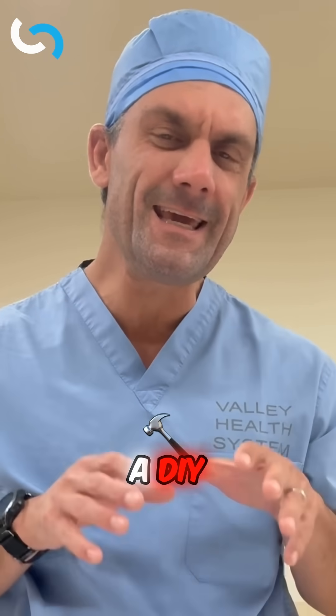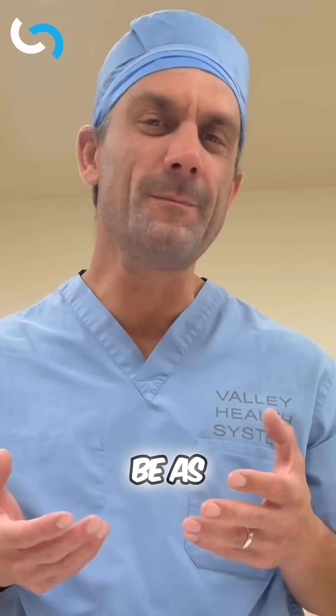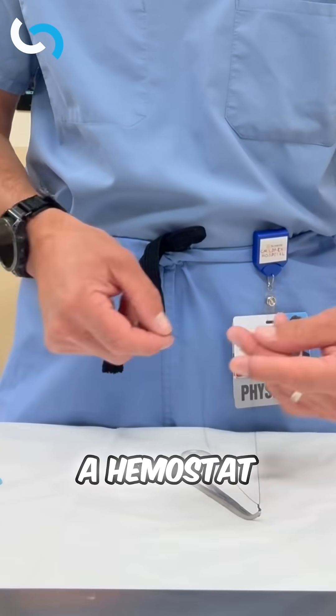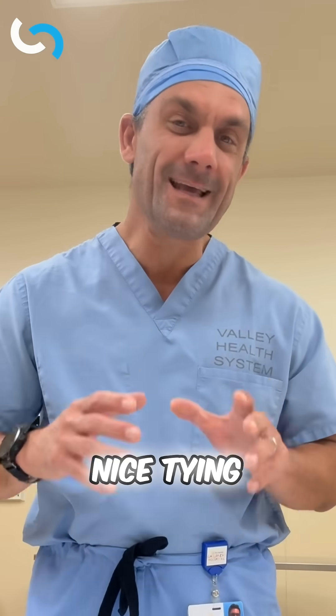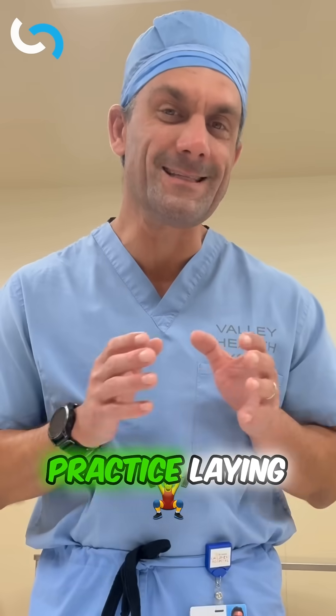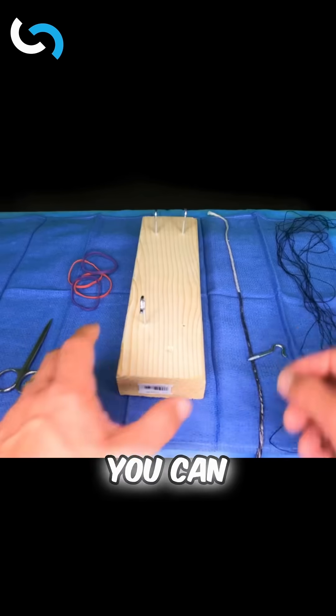An easy way to build a DIY knot tying station at home can be as simple as having a piece of suture on a hemostat or a tonsil clamp, or we can get a nice tying setup to give you some appropriate tension so you can practice laying those knots down perfectly.